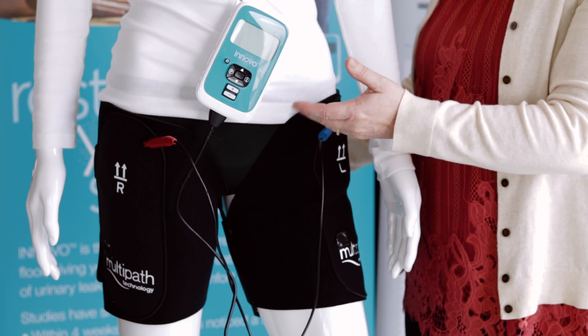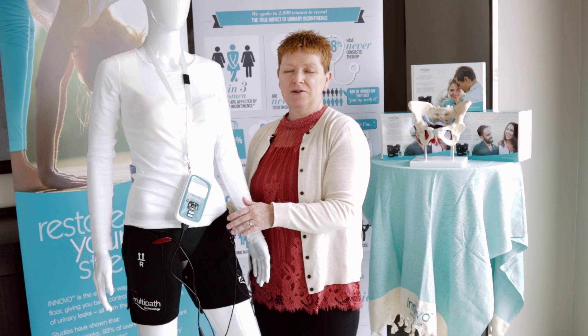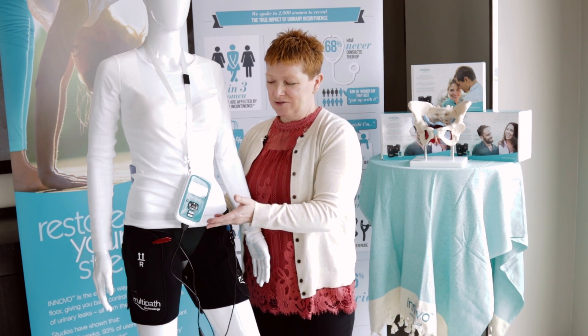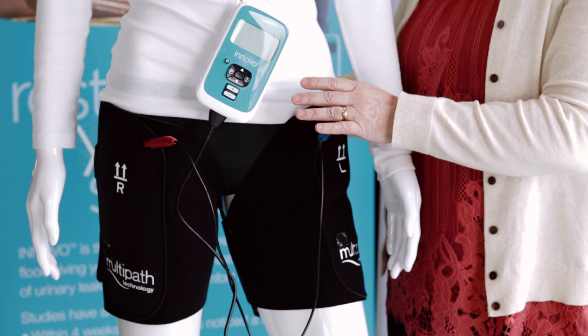When they have a pelvic floor contraction with the device, they'll stand for approximately 30 minutes. Some individuals will lie down or recline on the sofa if they don't want to stand for 30 minutes, and that's fine, but the optimum position is standing.